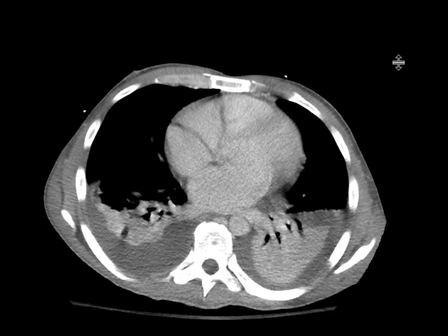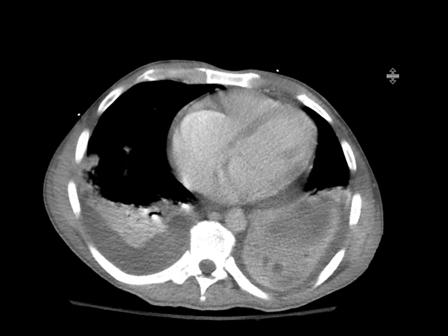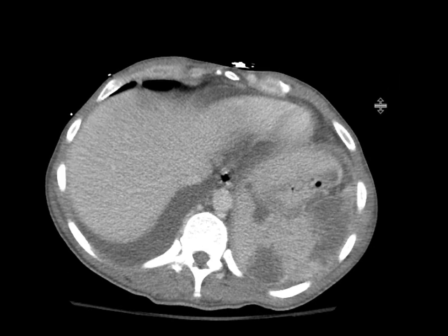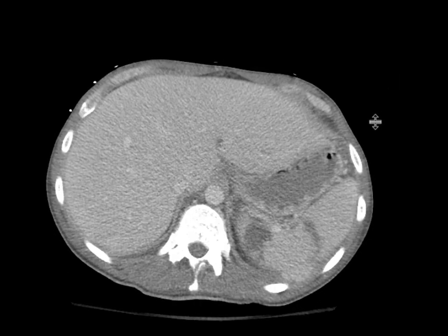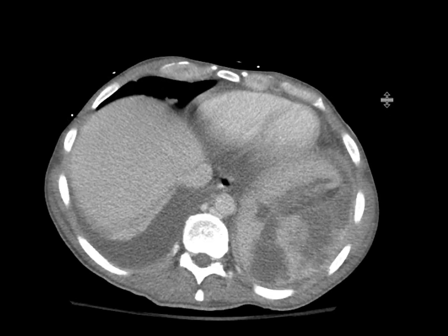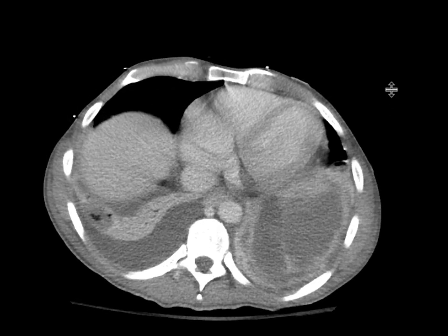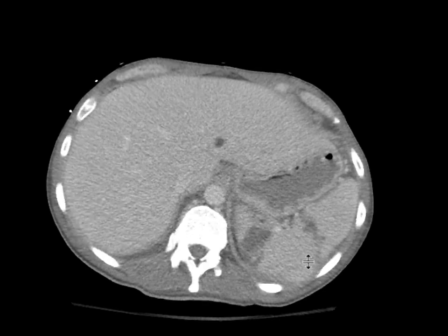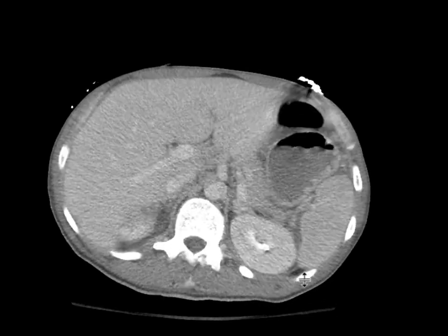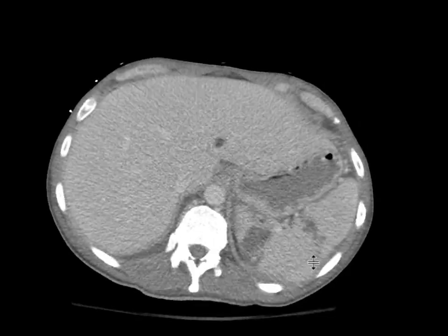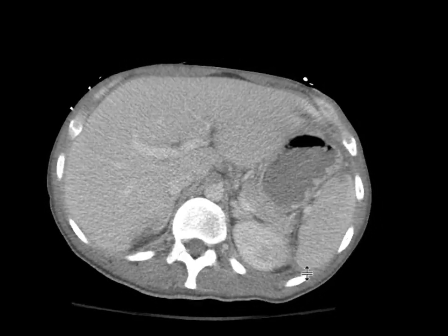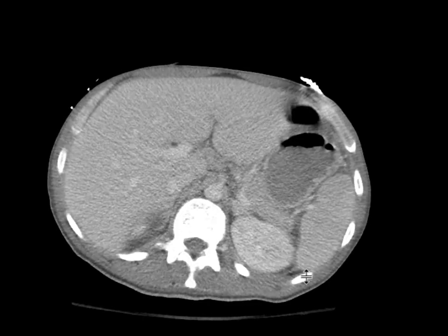This is a patient who had abdominal pain and got a CAT scan with intravenous contrast, and there are a couple of abnormalities we can see here. In the spleen, there are multiple linear to wedge-shaped regions of hypoenhancement seen almost throughout the spleen, though predominantly at the upper portion, so this is a great look for splenic infarcts.